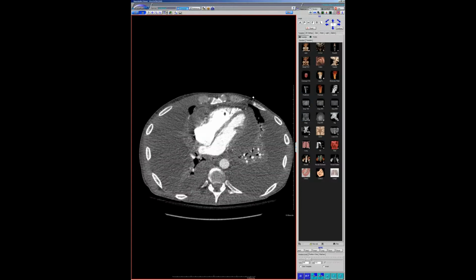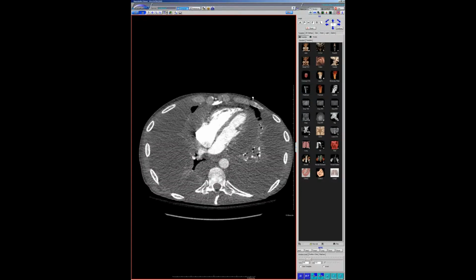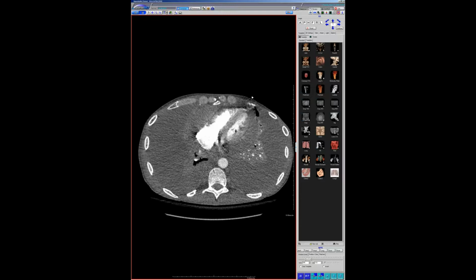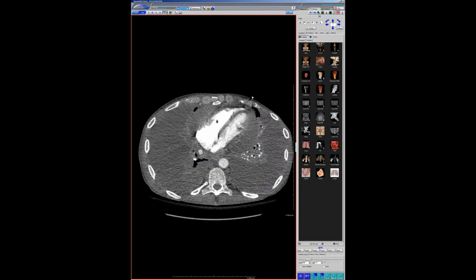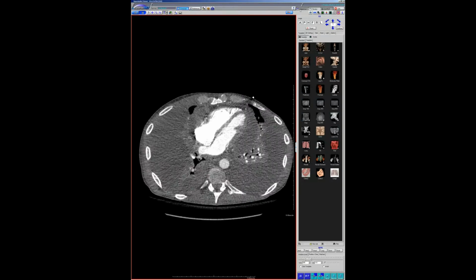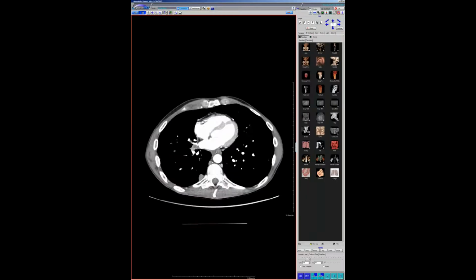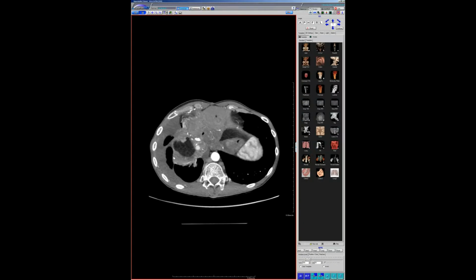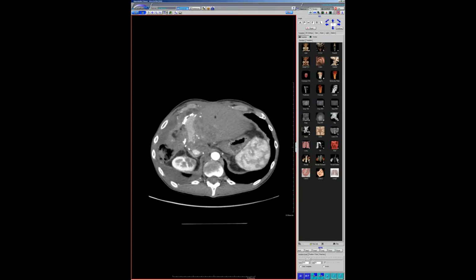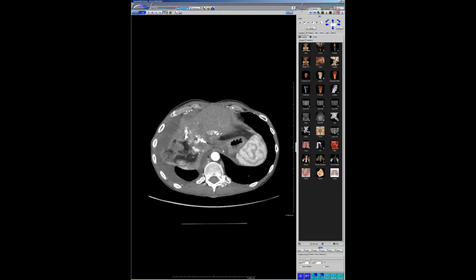You can see, on my other computer, I had the echo pulled up, which you don't need an echo to show the tamponade. I mean, this thing is dramatically compressing the ventricles and the left atrium. And so the guy had tamponade. So here, let me show you his CT from about a few weeks before, which showed no effusion, bad disease, this very nasty liver thing going on. I don't know what that is, just tumor and necrotic stuff.